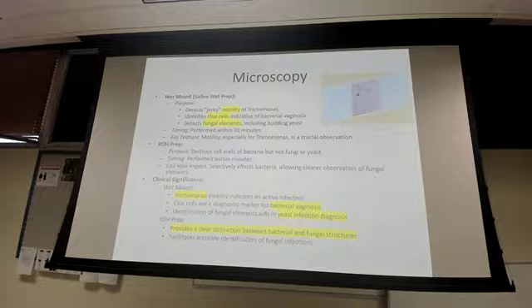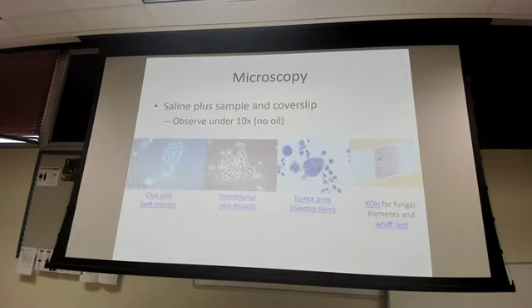All right? So in wet mounts or in saline wet preps, we're looking for things like trichomonas, clue cells, which is indicative of what? Do you remember? Bacterial vaginosis, and then those fungal elements, we're looking for those budding yeast. All right? This is usually performed within 20 minutes. Your KOH prep, we already talked about, we're looking for the fungal. And then, I think y'all have this because I have tested y'all quite a few times on this, but let me test you again, I guess.